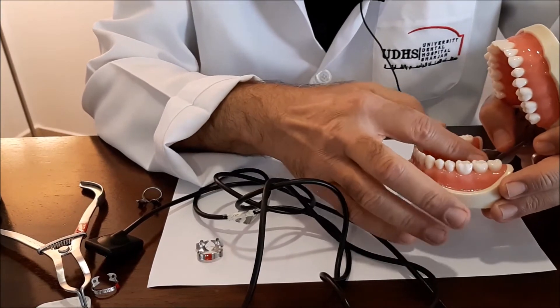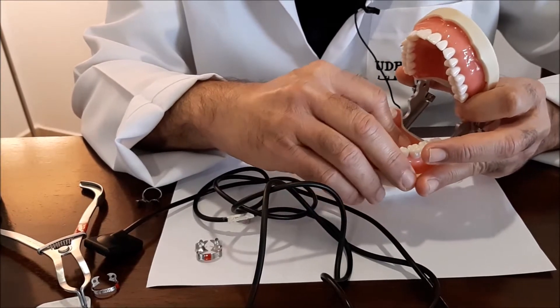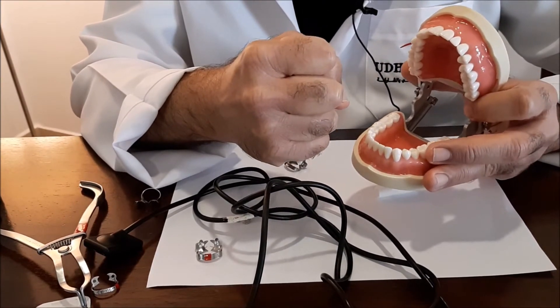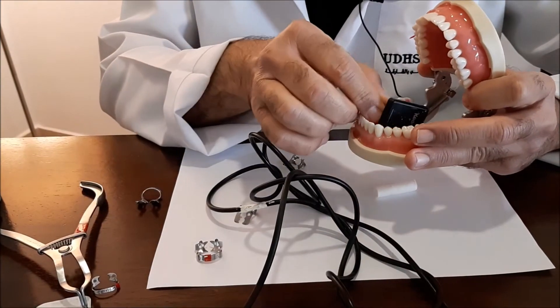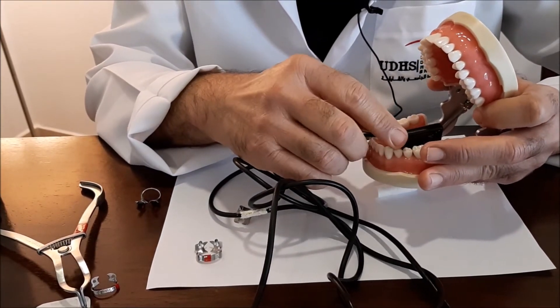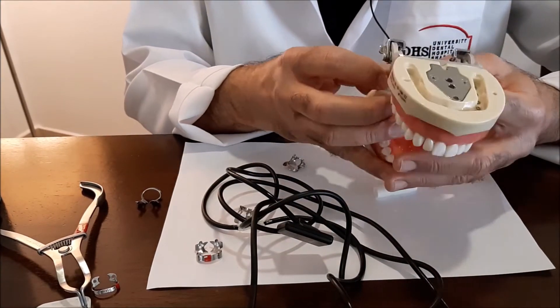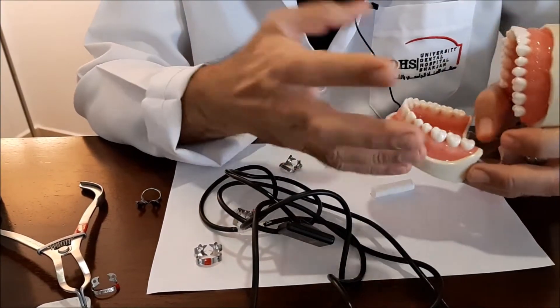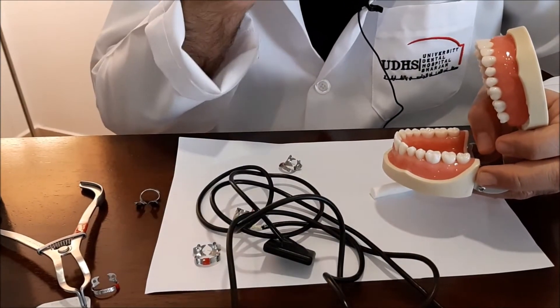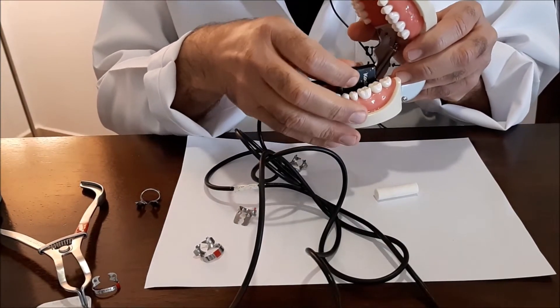Why? Because some patients, by reflex, when the film is inserted against the floor of the mouth, the muscle will tend to become tense. The more you push the sensor downwards, the harder the muscle will be. And sometimes you will end up initiating the gagging reflex. So what you do here is distract the attention of the patient from this area where the sensor is touching and the reflex tensioning of the muscle occurs.